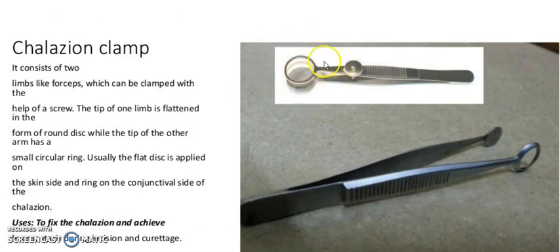It is a chalazion clamp. It consists of two limbs like forceps which can be clamped with the help of a screw. The tip of one limb is flattened in the form of a round disc, while the tip of the other arm has a small circular ring. The disc is applied on the skin side and the ring on the conjunctival side of the eyelid, to fix the eyelid and achieve hemostasis during incision and curettage.